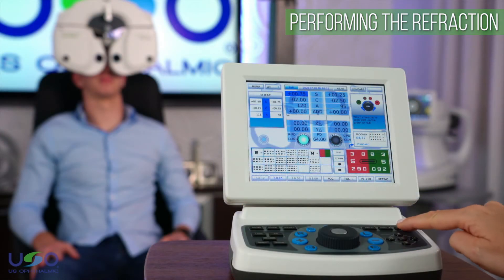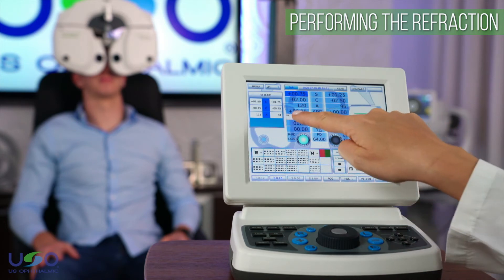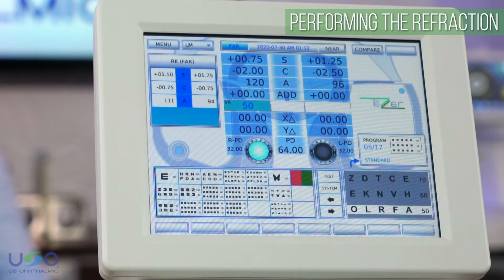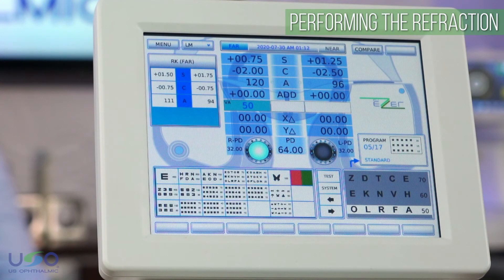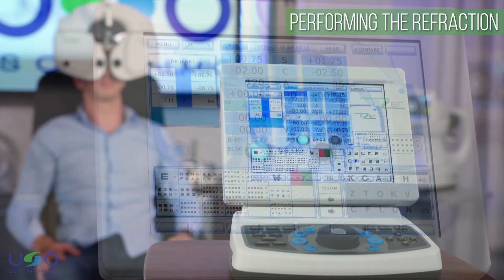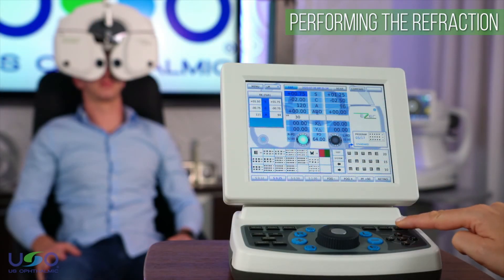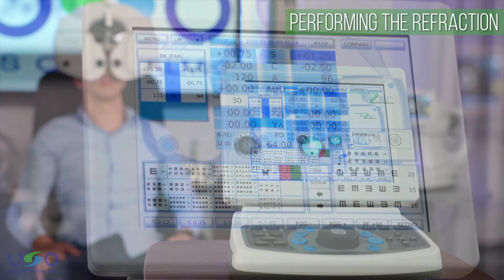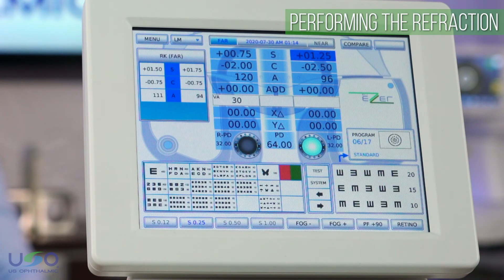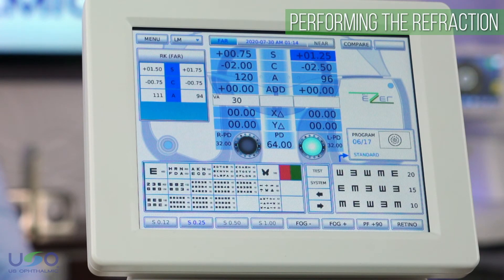The next step is to see the visual acuity the patient achieves with this correction. Once the refraction on the right eye is complete, the program automatically sets up the occluders, lenses, and parameters of the refractor head to perform the same procedure on the left eye.